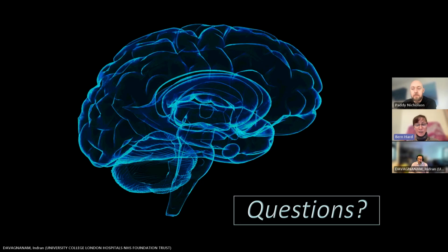There are just a few more questions that have come in the last few minutes. Somebody's asked, does superficial siderosis show on the usual scans that would be done for leaks, or would we need to look specifically for that using different imaging if we were suspecting it? If you were to do a comprehensive protocol looking for a leak, it is part of the suggestion that we've proposed, but an ordinary or routine brain or spine scan would not necessarily have the right component sequences to detect it, because it can be quite subtle. That's worth knowing, isn't it?